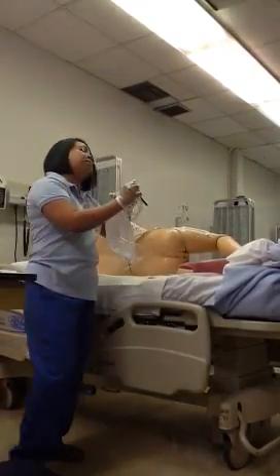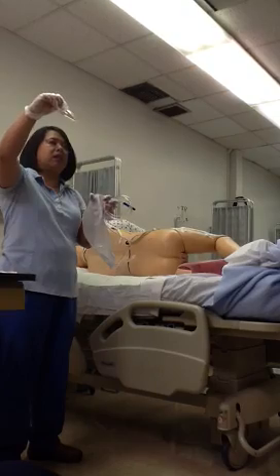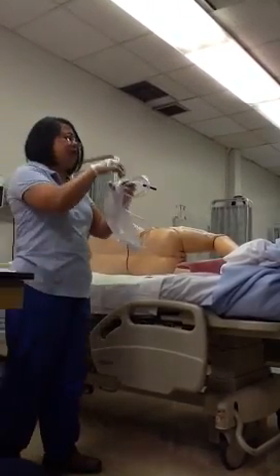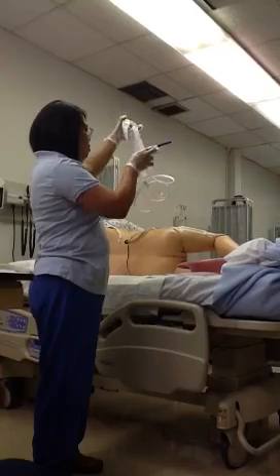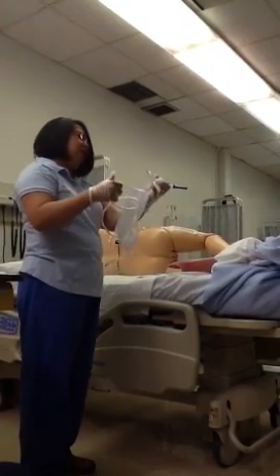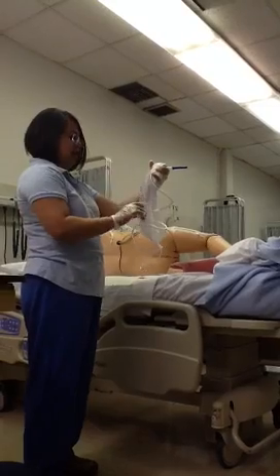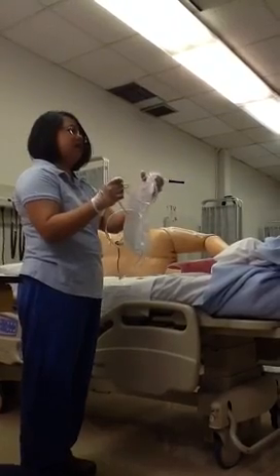Once it's filled up to the 500 mark of warm water, then there is a packet of Castile soap, okay? I'm sorry, I said glycerin. Castile soap. Open this up and pour this into the bag, all right? Shake the bag up a little bit, and then you're going to go over to the sink, and then you're going to do what's called priming this tubing. Now this tube is filled with air. You don't want air into your patient because it's going to come back out. All right, so you're going to hover over the sink and you're going to unclamp and let that warm soapy water from the bag flow into this tube and then out the other side. And you just want to clear the air. Once the air is all cleared, go ahead and clamp it back. All right? Is everybody with me so far?